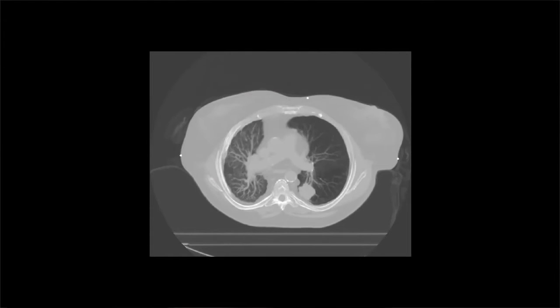Time is the 4th dimension. Not quite as slick as general relativity, but you say, all right, we've got time, which means what happens if, let's say, I'm breathing. Well, I could have a snapshot of my CT at one moment, and then as I breathe, another snapshot. You can actually find these online too, where people will have 4D CTs, essentially a bunch of CTs over the course of your breathing, and you see how your internal anatomy changes as you breathe. They can do this with MRI as well.